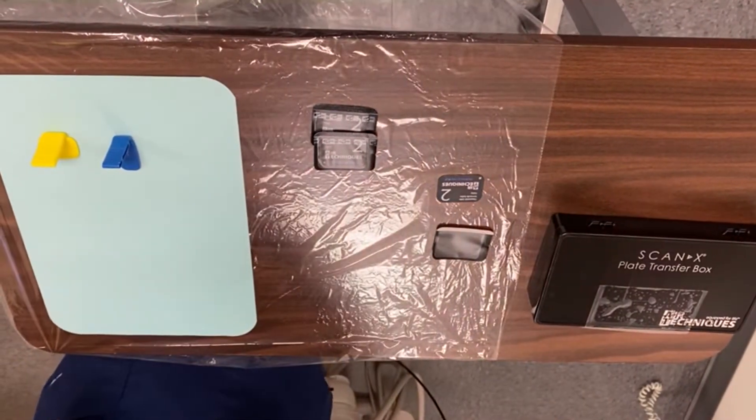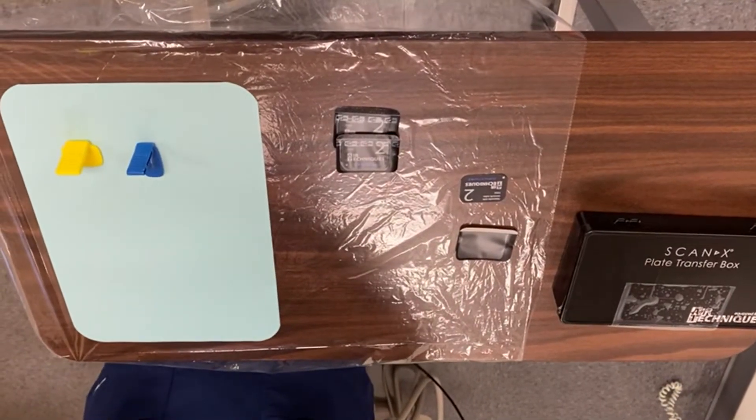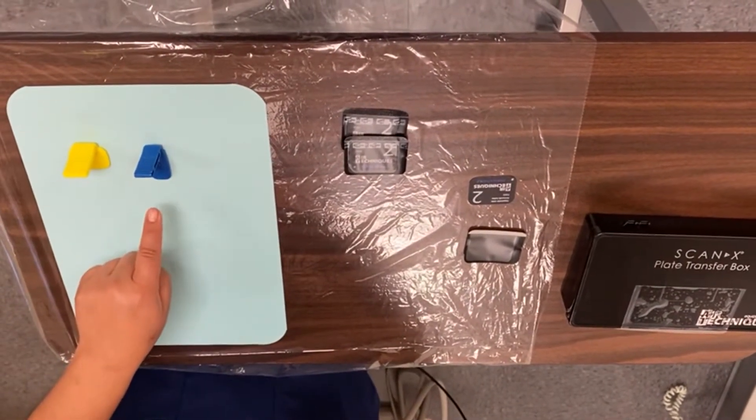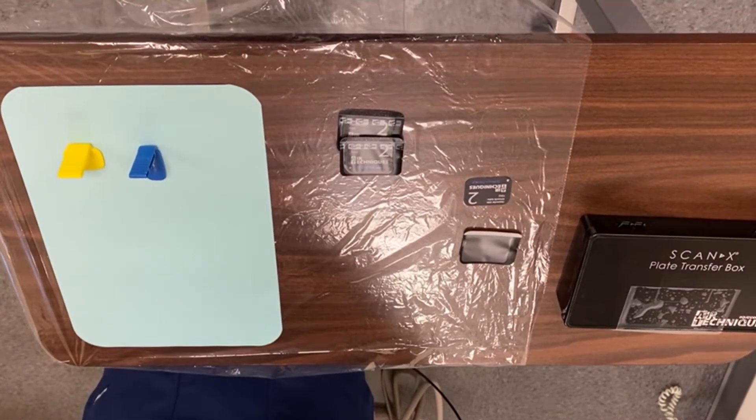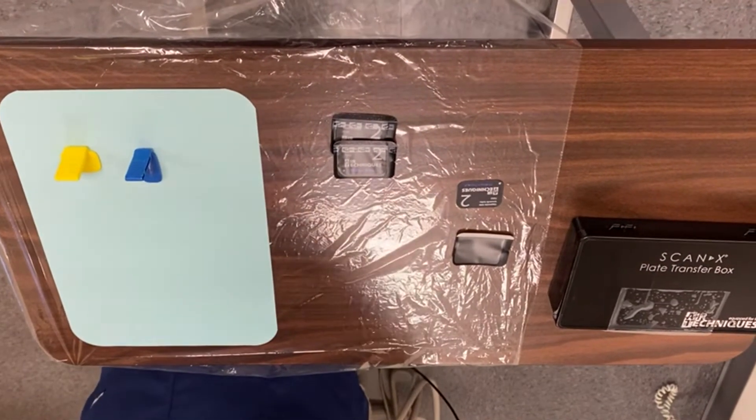From there, we need the bite blocks, also known as the foam holders, to take whatever x-ray we need, whether it's an anterior PA or a posterior PA.